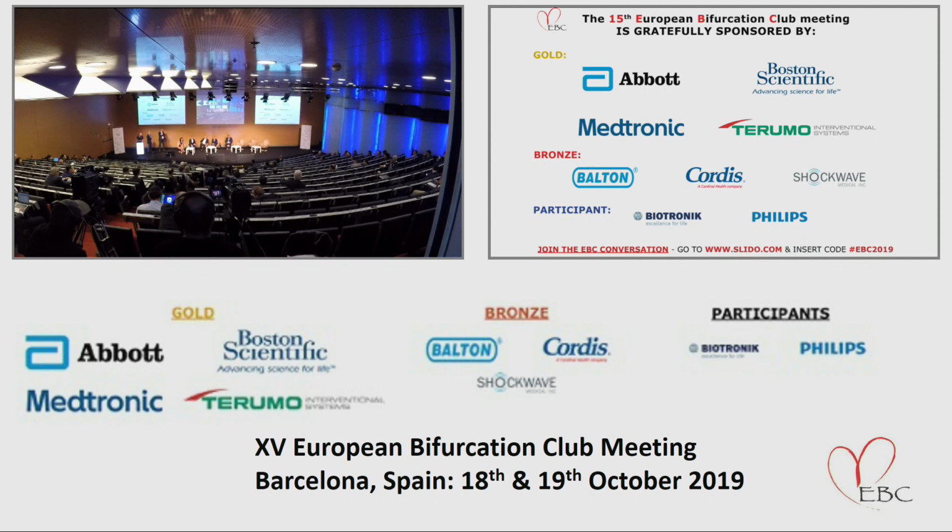So you have the detachment not from the carina, but from the side, because you have the protrusion, so you have to anchor. This is a small anchor, and then you prepare the main vessel. And so if you do a kissing first, and because you prepare the vessel, you anchor the side branch, and you go, it's the best way to do.